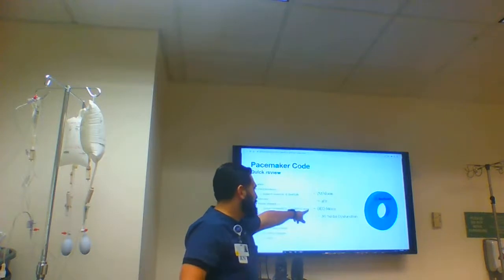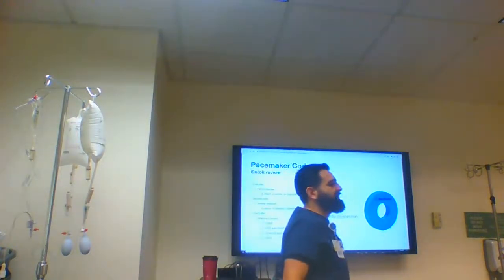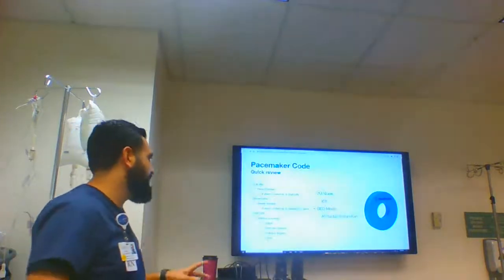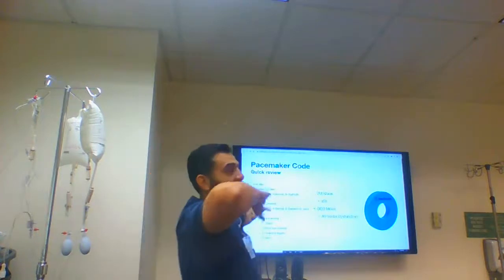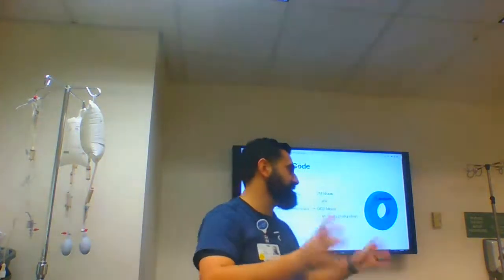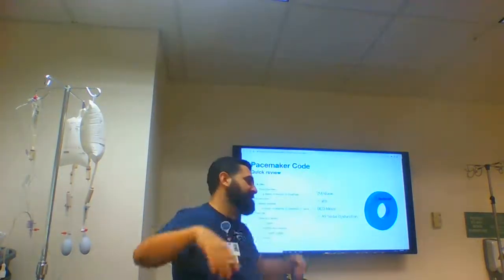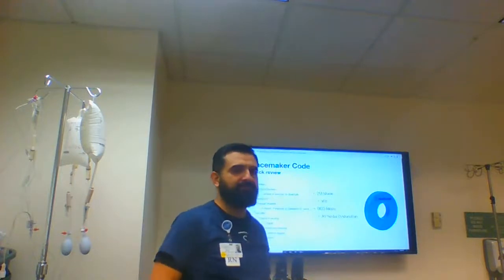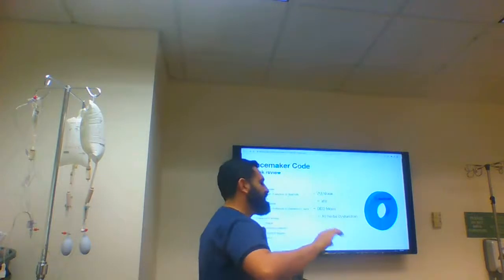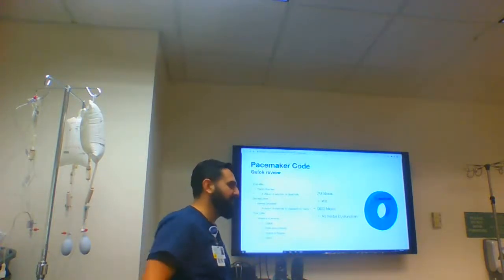And we will typically use these for AFib. So VVI, you'll typically have a higher rate. Like VVI will be like 90, because it's typically for AFib. Upstairs, they're doing whatever they want, and we care about downstairs, right? We care about the ventricles, right? Because we're fine with AFib, but we're not fine with VFib, right? It's unanimous. So for AFib, we'll typically put VVI at a higher rate, like 90 is the usual one.